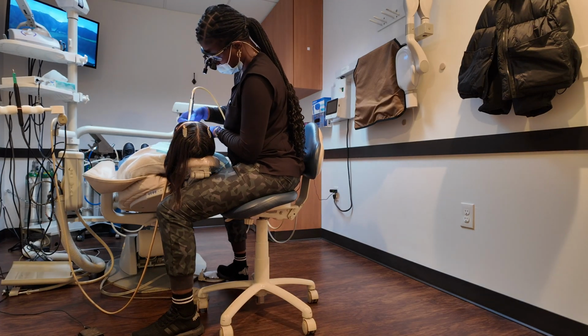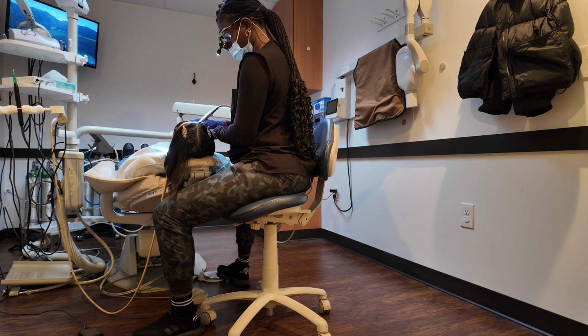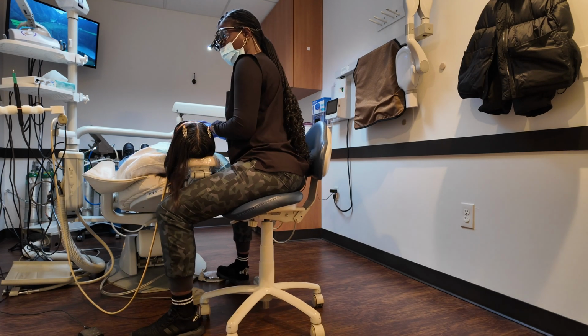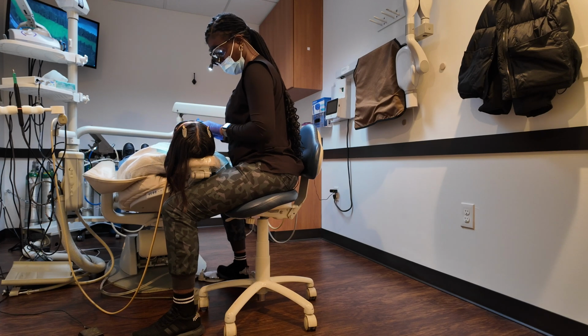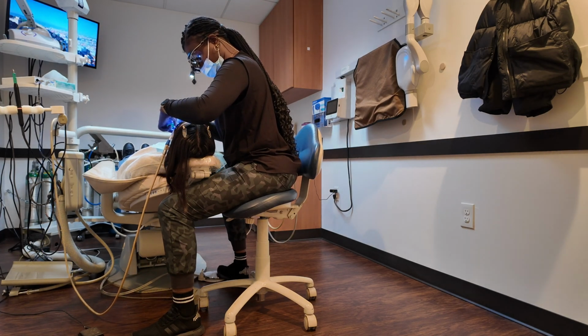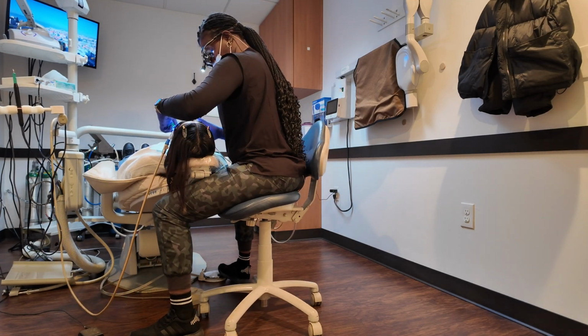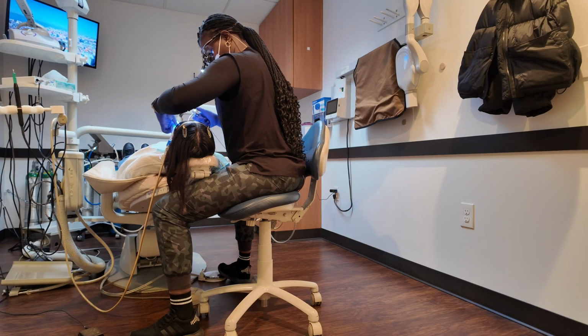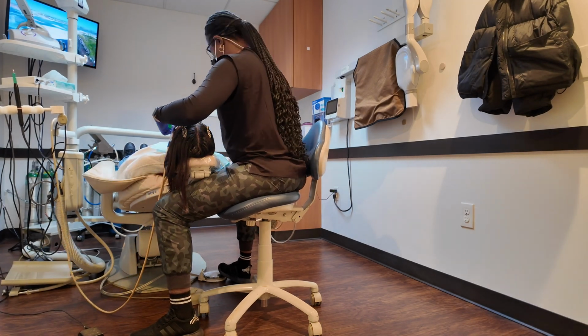I will say that there are certain times where there are tiny little pieces of debris in between the teeth that the only thing that's thin enough to be able to get it sometimes is the floss. And so I find that that's the best result for just making sure that everything is truly out of the way. And if there's anything that you might have missed with your other instruments, you'll definitely be able to scoop it out with your floss. And so I'll floss and then I'll polish last.